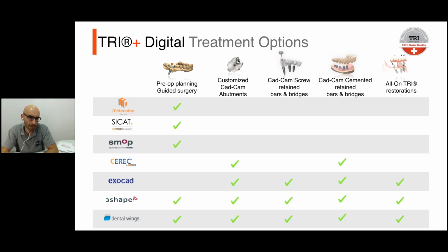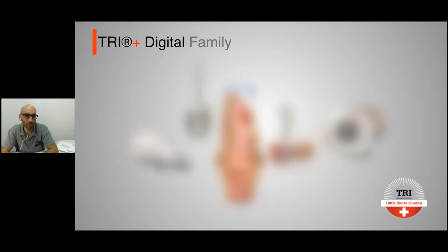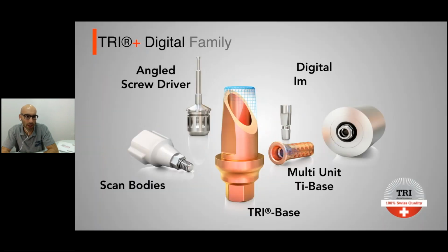So it's your choice. It depends on the planning from the dentist. And then you can choose. You can do CAD/CAM screw-retained bars and bridges. So all of them are available for the most used software on the laboratory side. And all these treatment options need some components that come from this TRI digital family.